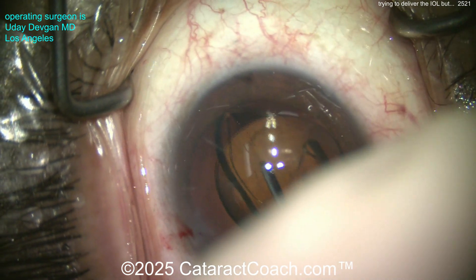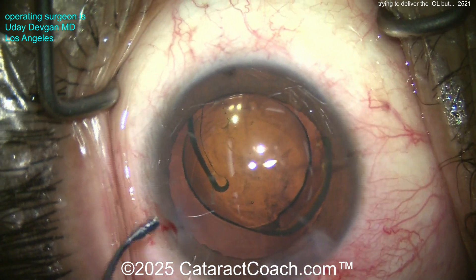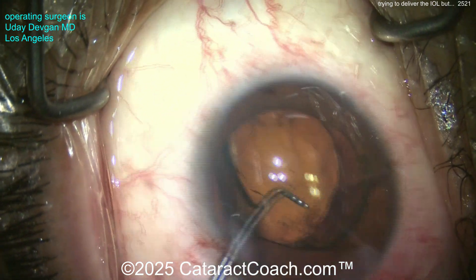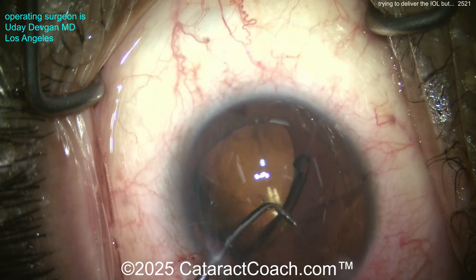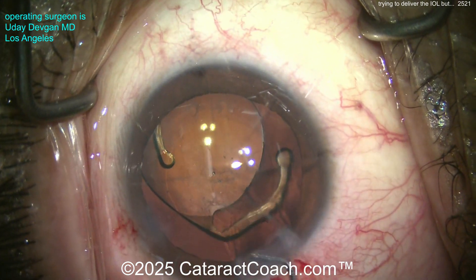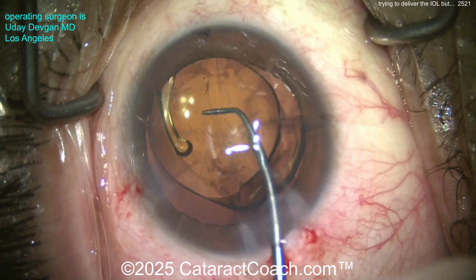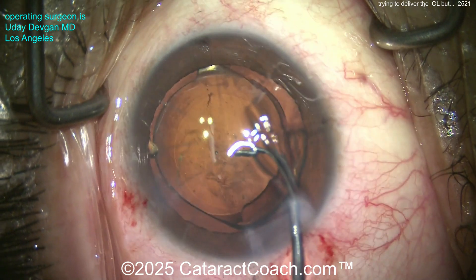Now what do you need to do at the end of the case? We should check the incisions with fluorescein dye — do a Seidel test — to make sure those incisions aren't going to leak at all. Let's get the lens into the capsular bag, get it delivered where we want it, and get that haptic in the bag too. Remember, be gentle.